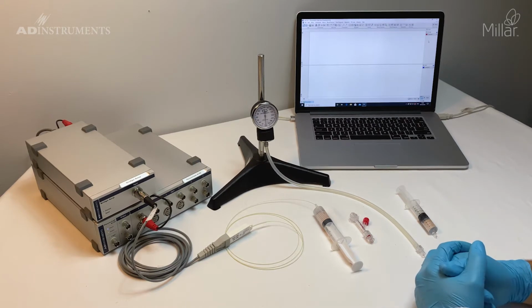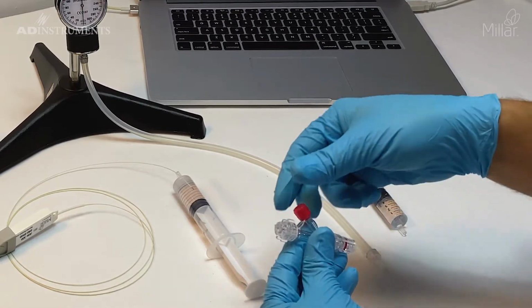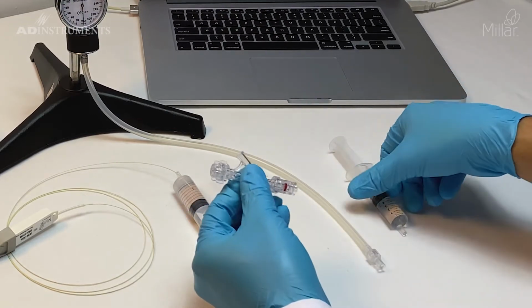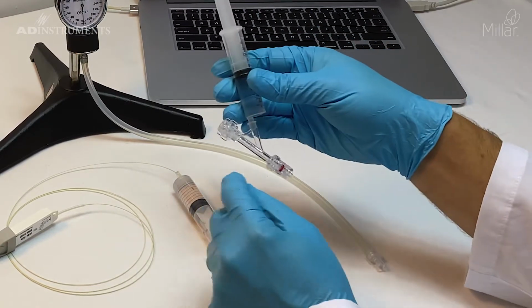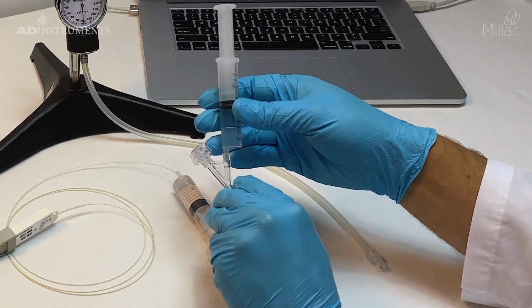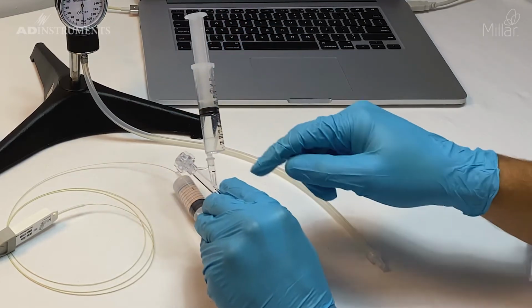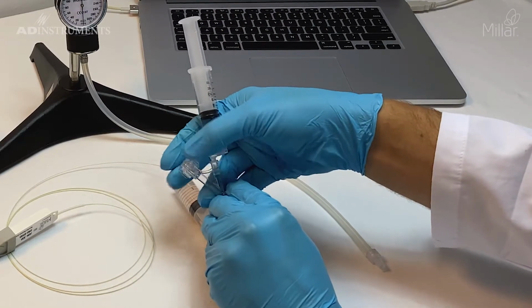The first thing I'm going to do is fill up the valve with some saline for the catheter. I do this by removing the cap, making sure that the valve is all the way open. I'm then going to connect a syringe with 37 degree saline. I close off one end of the valve and then slowly introduce saline into the valve. You can see that there is fluid inside the valve, and then I can close off the valve.